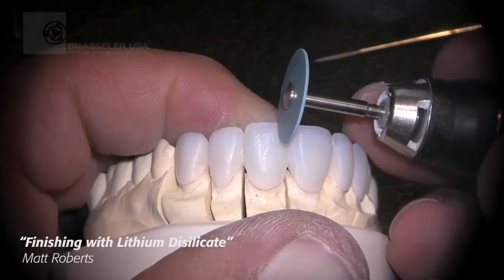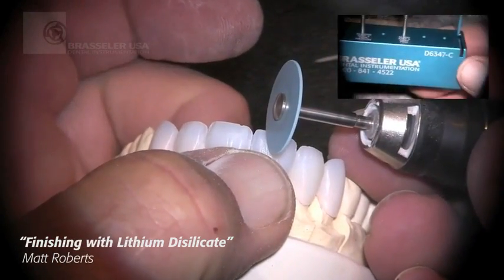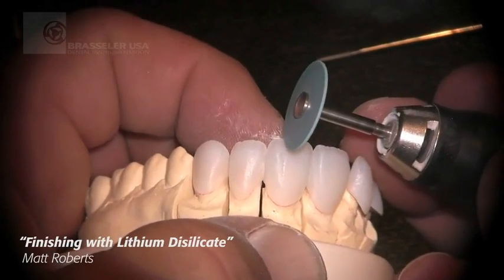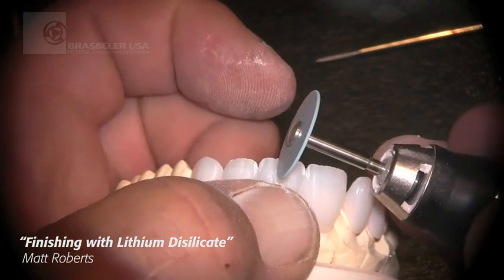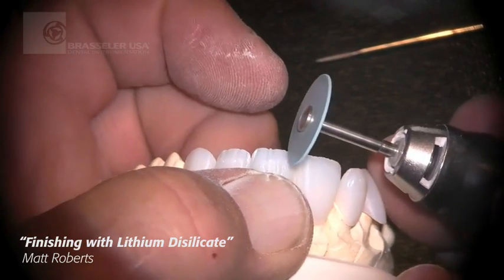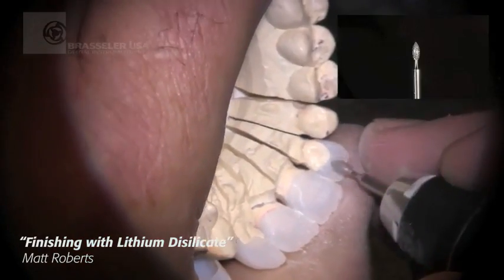Then we'll go to the new little disc from Dialite, again from Brassler. The coarse medium grit in the micro thin disc works very well for detailing your incisal edge and creating the lobe formations that you would see within a natural tooth. We work with very thin incisal edges.